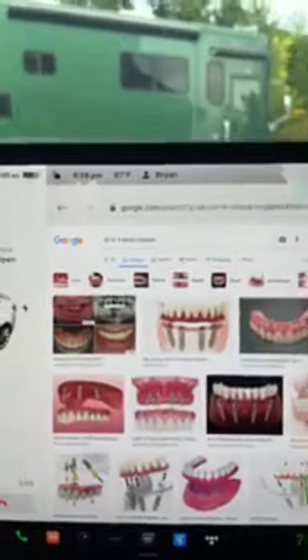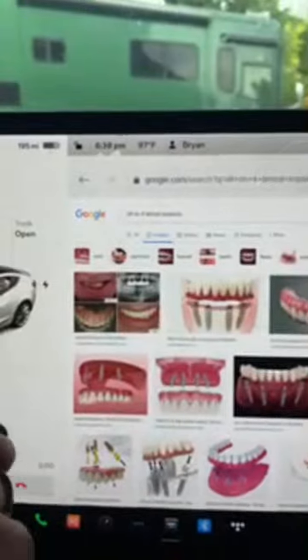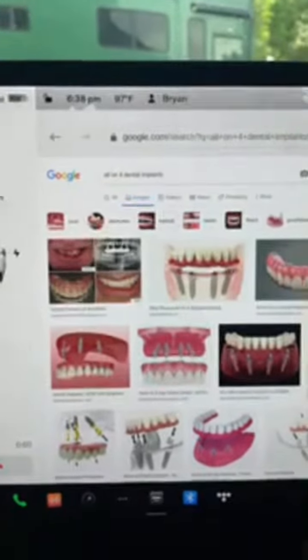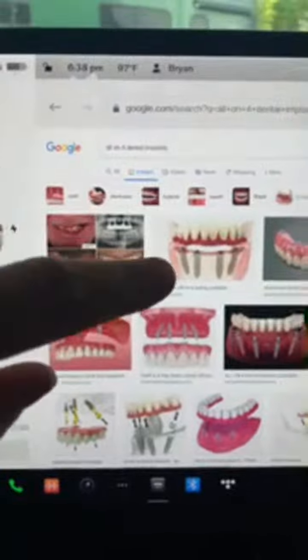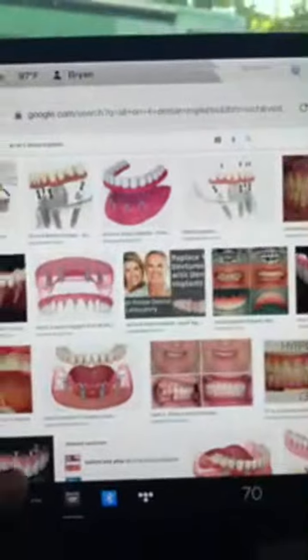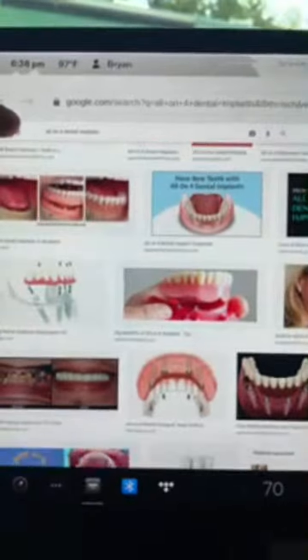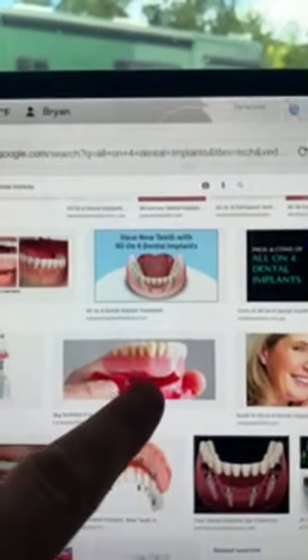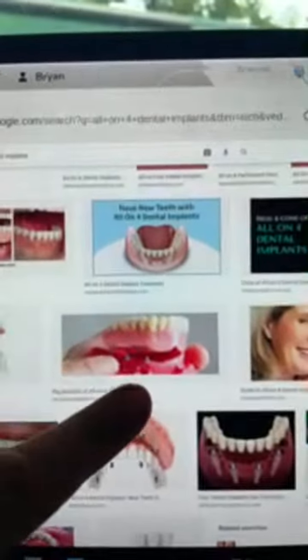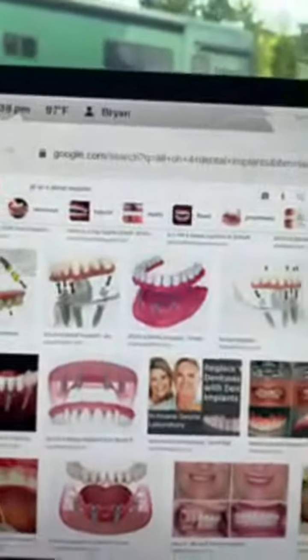You can see that this is much smaller than any of the other options, whether it be a denture, overdenture, or bar overdenture. Meaning there's no flange. You'll notice that there's no extension. There's no corners that go into the mouth. You can see that everything is like one big bridge. Versus here's an example of a denture. Do you see how there are corners here and they overlap over the bone? Compared to this here, do you see the difference? Huge difference as far as material.